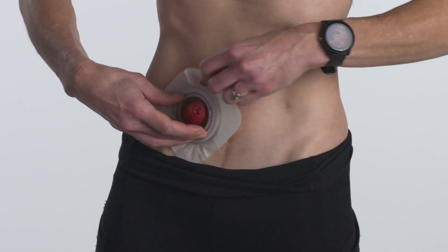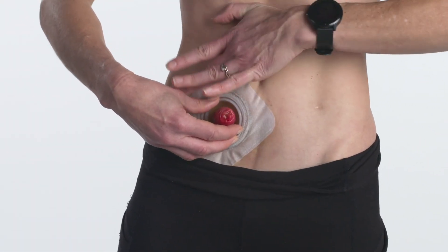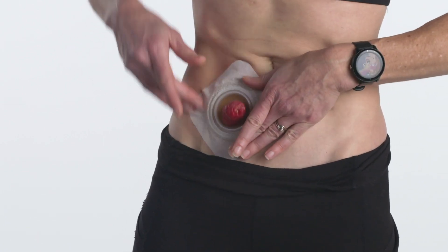Remove the release paper from the fabric collar and press against your skin, smoothing out any wrinkles. Hold your hands in place to ensure a good adhesion.